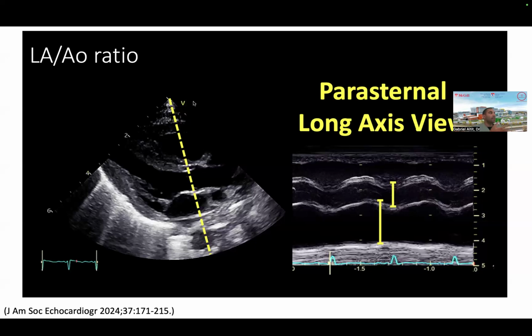Yeah, so you're right. At low dose, as soon as you reach 0.05, 0.1, you start having much more of this vasoconstrictive effect. And so it can sometimes worsen this component of the LV dysfunction. It can start facing a lot of afterload, but sometimes we have no choice to get a bit of low dose epi. Okay, LA on aorta ratio, very debated as well.